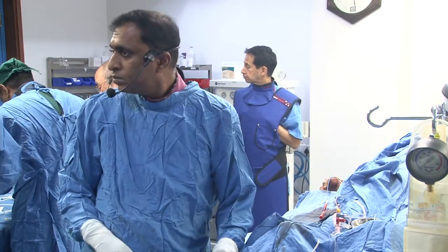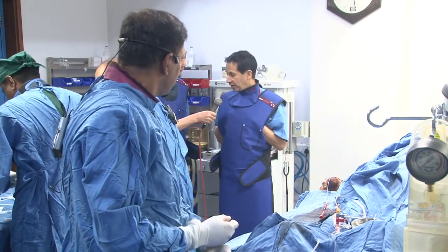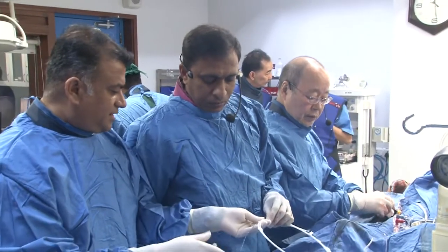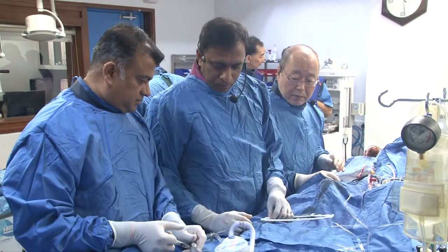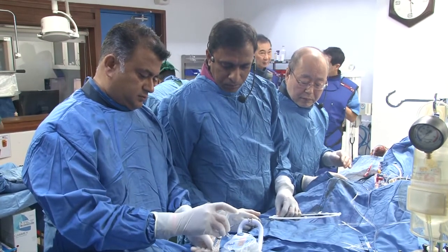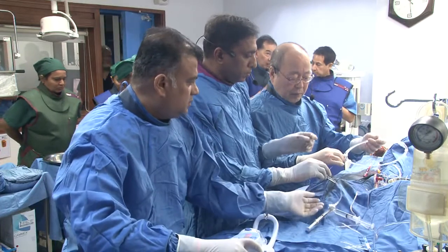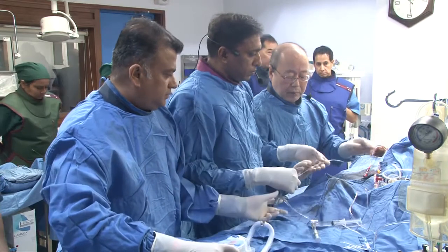Would you do 1.75 in this vessel? I would do what the IVUS or the OCT tells us to do. Honestly, fluoroscopically it doesn't seem like too much calcium. If it's not overly calcified, I would be with Malcolm here: balloon, nitro, IVUS-guided stent diameter. I think that's what we routinely do. Only if I cannot put the balloon down in an undilatable vessel, then I do the rotablator or laser. But if the balloon can dilate, I will not consider that.